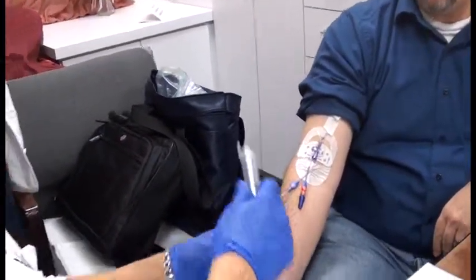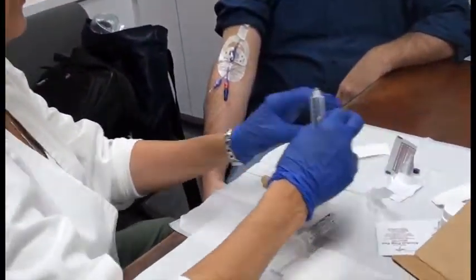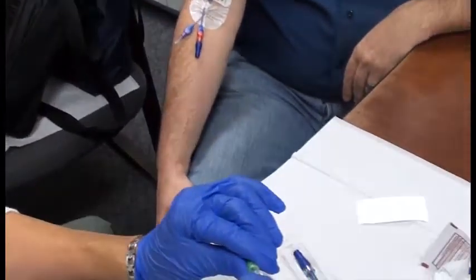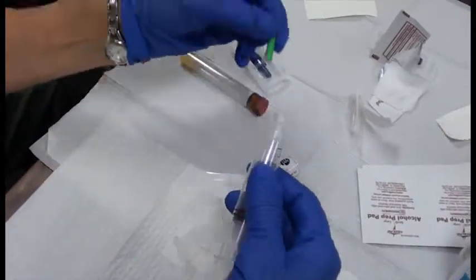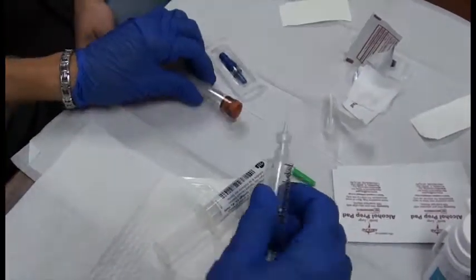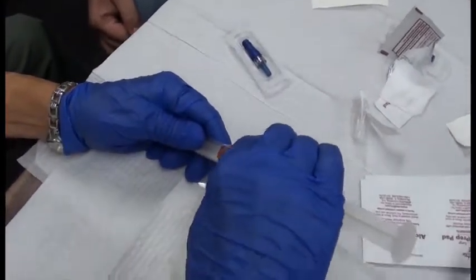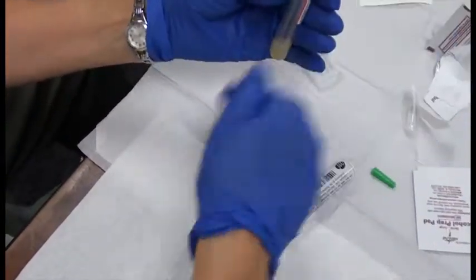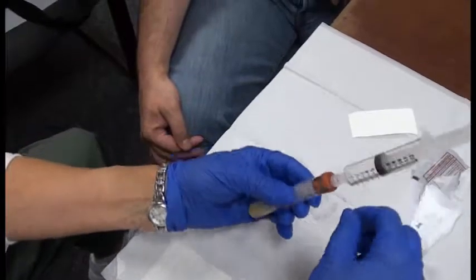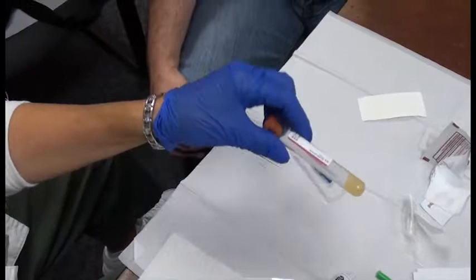And then I'm going to get the little Christmas tree and put it together. Take off the cap and connect that onto the lab tube. And if there's actually blood in that, it would vacuum into the tube. Once I have that full, I'm going to throw that into the sharps as well.